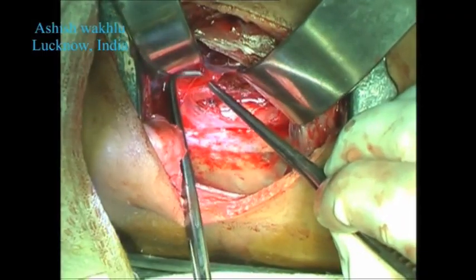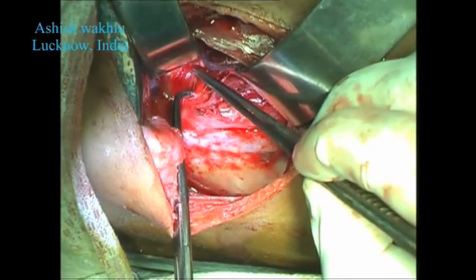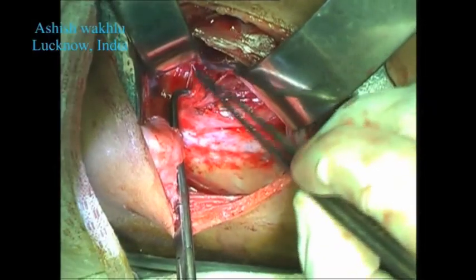So just under that gap in the mediastinal pleura, where the tip of the Rumel's artery forceps is currently, is the bifurcation of the trachea and the stump of the right main bronchus.